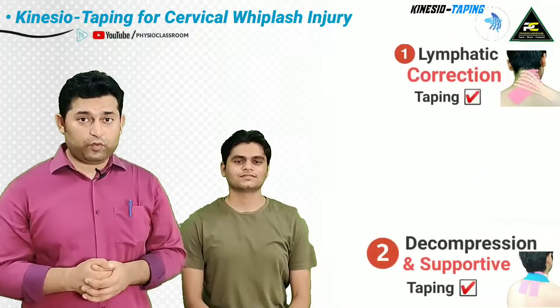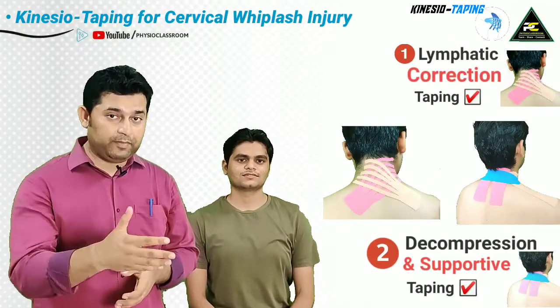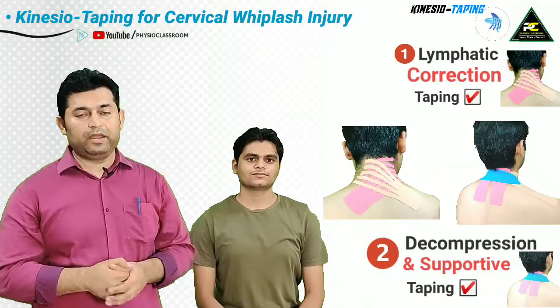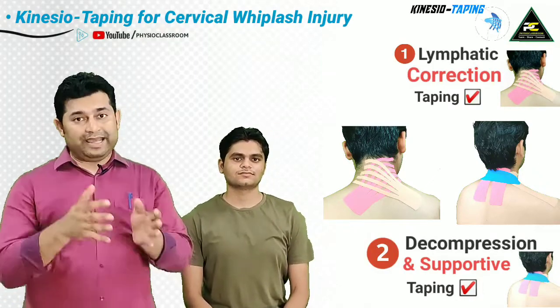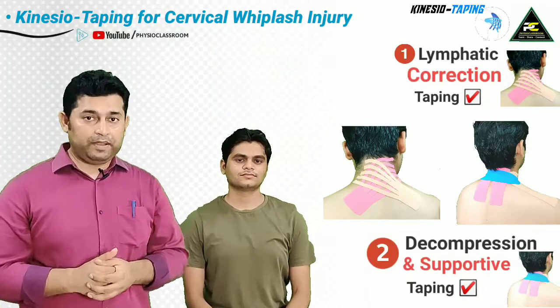So please remember that this was one of the many ways in which we can tape a cervical whiplash injury. A physiotherapist should always assess the patient, and depending on the examination, the taping can be varied.